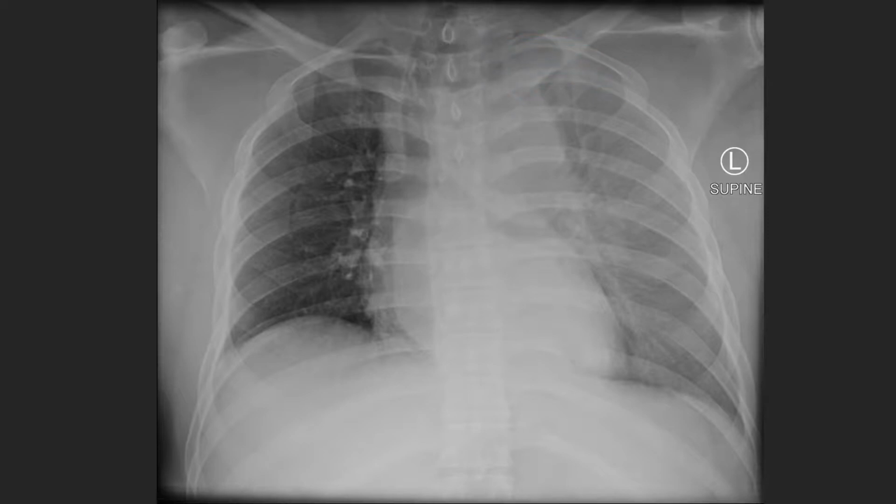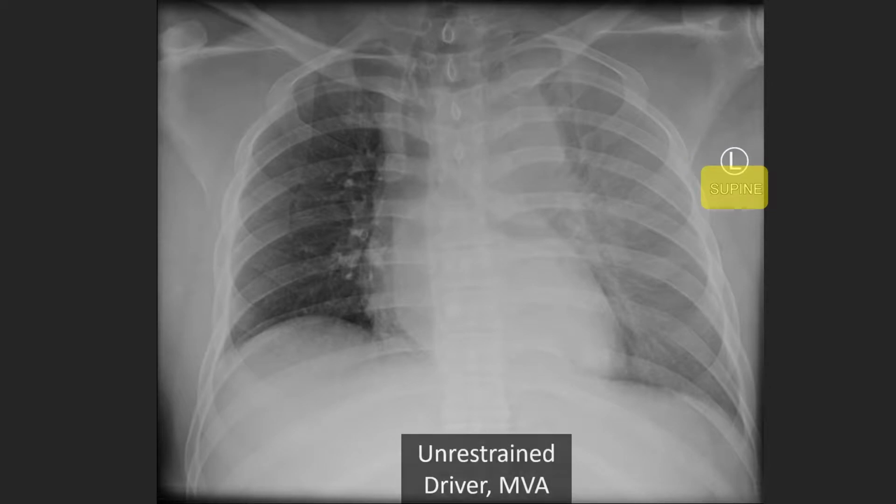You may be wondering, wait a minute, where is the blunting of the costophrenic angle? But how does one have to be positioned to develop blunting? They have to be upright. And how is this patient positioned? They are positioned supine. So when supine, the fluid tracks along the posterior tracts, evenly resulting in this vague density with fluid accumulating near the lung apex.